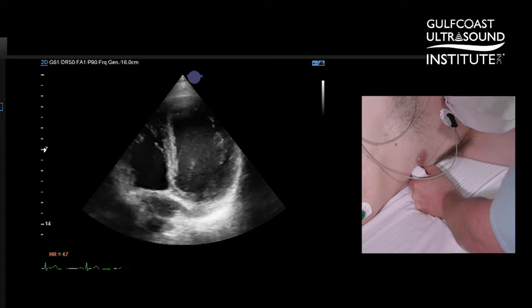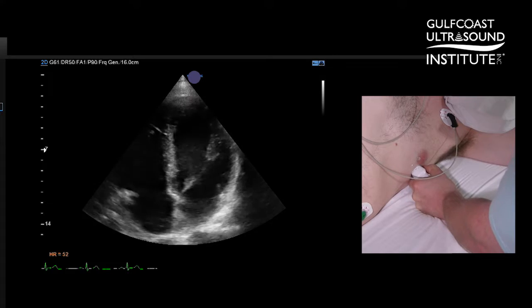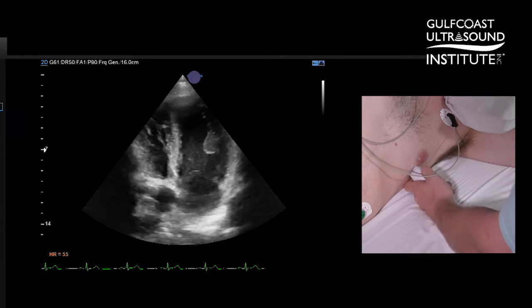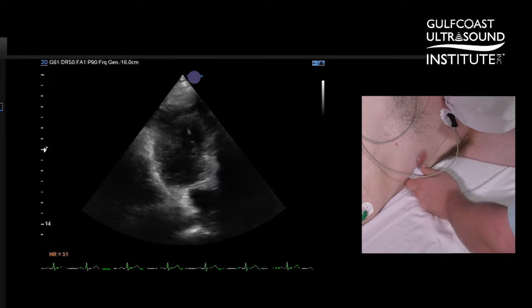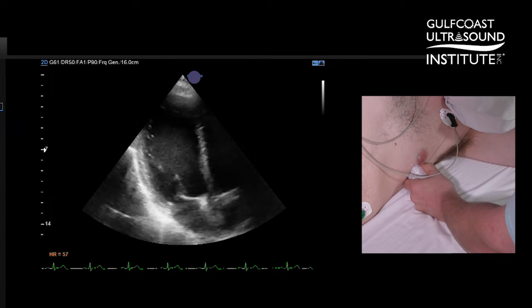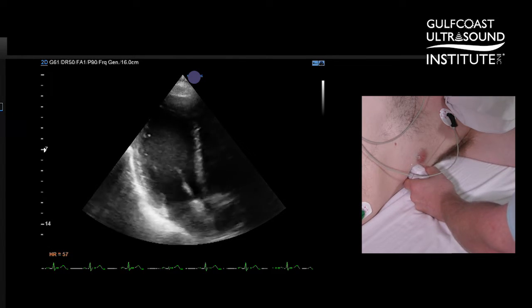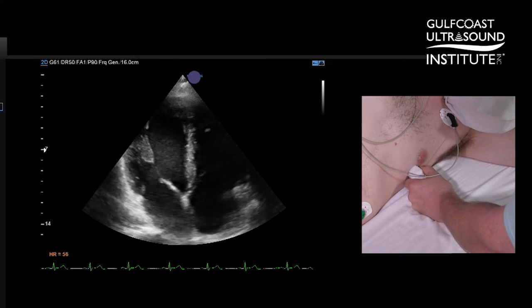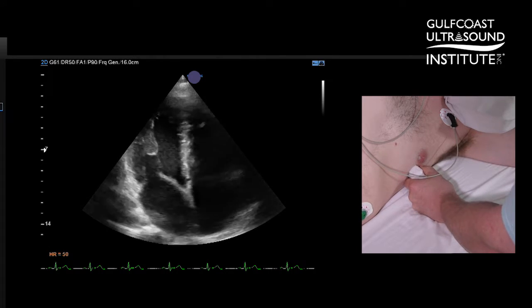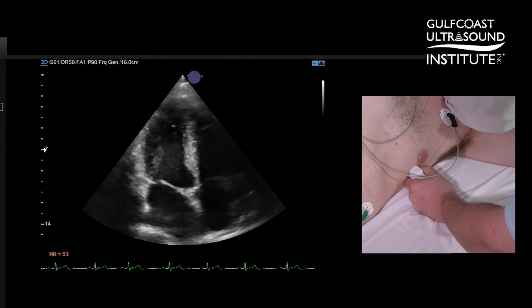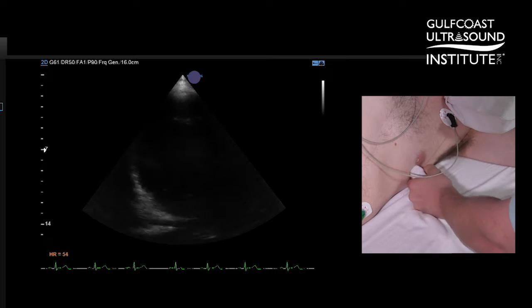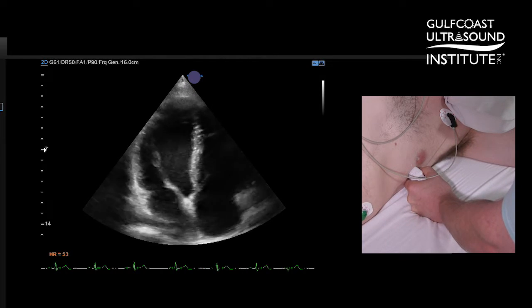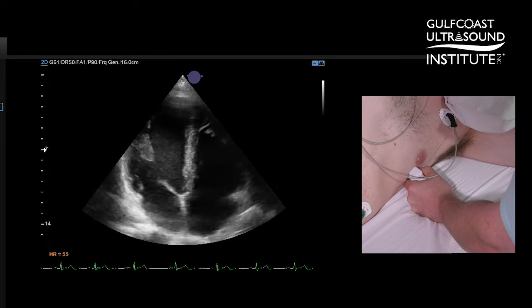I think it's always important to look at all of our views for the tricuspid valve. One last view to show you: from an apical three-chamber view, if we continue to rotate counterclockwise we can bring in a reverse four-chamber where we will actually see the tricuspid valve on the right-hand side of our screen and the mitral valve on the left-hand side.